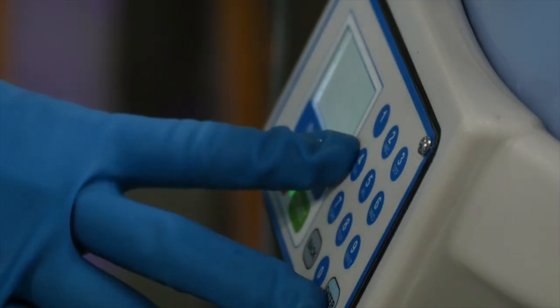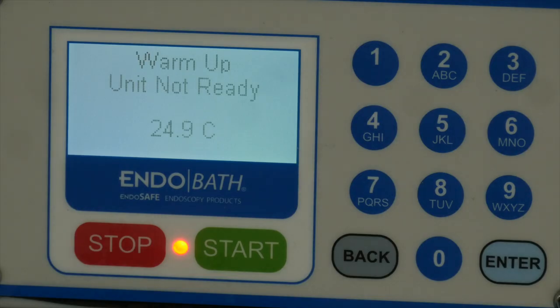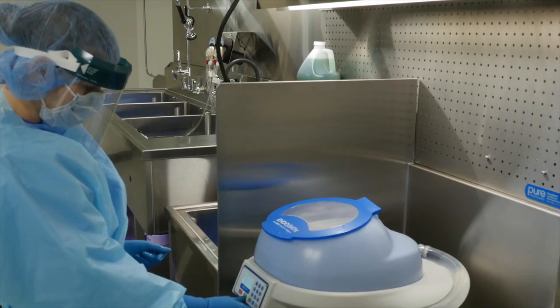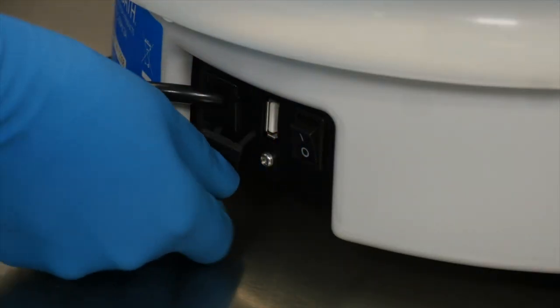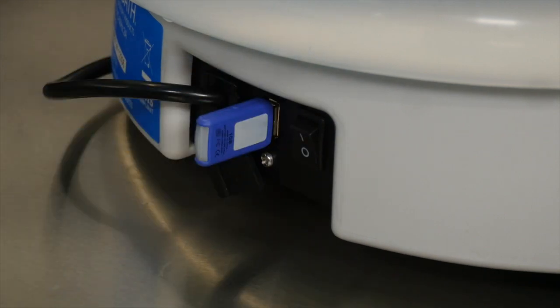The EndoBath high-level disinfection device automates some HLD functions and features an enclosed, temperature-controlled basin in which scopes can be disinfected without exposing staff to dangerous fumes or chemicals. Necessary HLD documentation is built into the EndoBath and features a USB port to save data and meet ANSI-AIME documentation requirements.